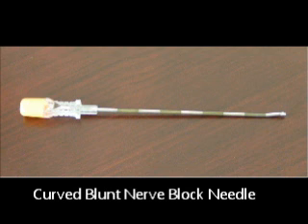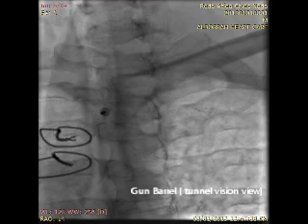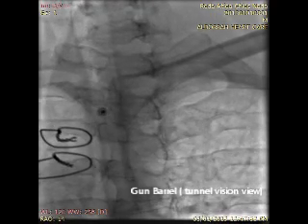A blunt curved nerve block needle is used for this procedure. The needle is advanced to create a gun barrel or tunnel vision view just lateral to the body of the vertebral body.